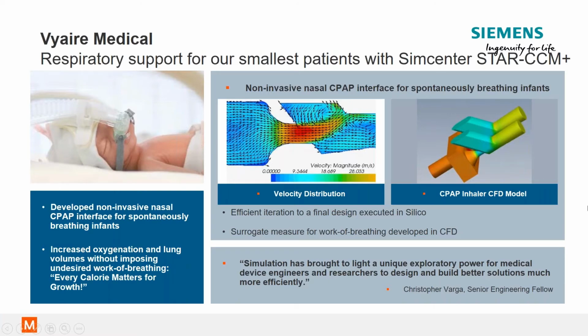And starting with Vyaire Medical. So Vyaire Medical have been looking to develop respiratory supports for patients, typically premature infants with underdeveloped lungs. And Simcenter STAR-CCM+ has helped them to improve their design so that whilst the system provides an increased oxygenation, there is no additional energy required from the infant to take a breath. For that, they first had to use surrogate models in order to develop a CFD model that was accurate enough to replicate the patient's breathing.